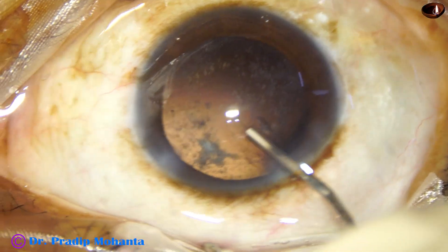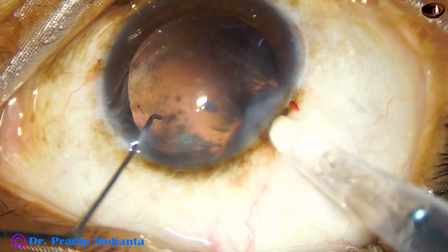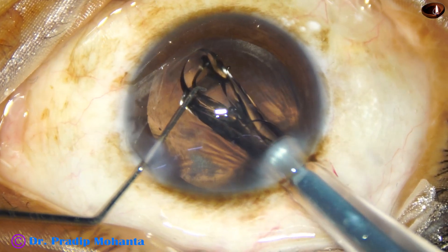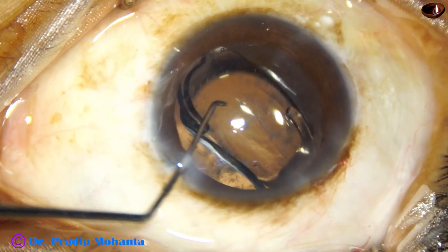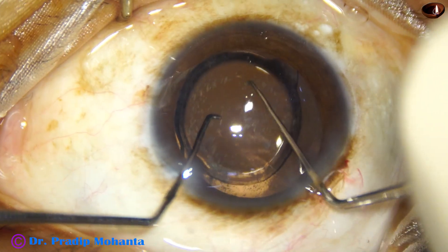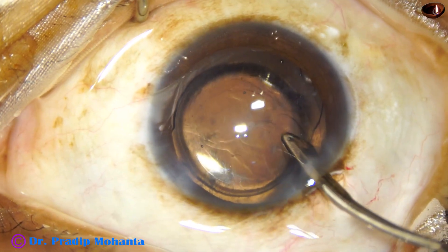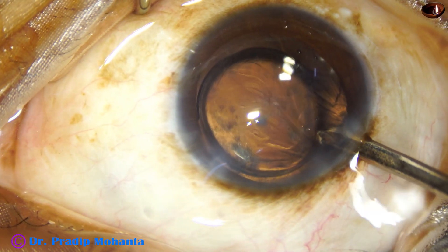Injecting Visco to fill up the bag. A hydrophobic acrylic single-piece monofocal aspheric intraocular lens is being implanted in the capsular bag. This is a C-cartridge. The lens gets compressed, so be slow in injecting — because if you inject too fast, suddenly it can go as fast as a bullet and go into the vitreous. You can use moderate speed on the first half of the lens coming out, then stop and push very slowly. Place the lens in the capsular bag and start removing the viscoelastic substance.